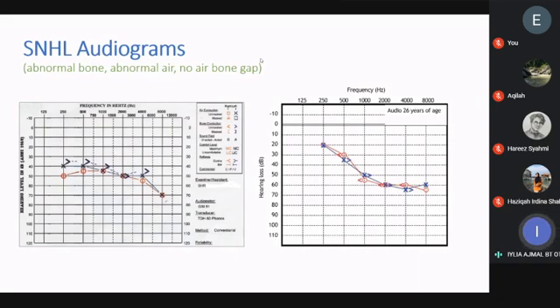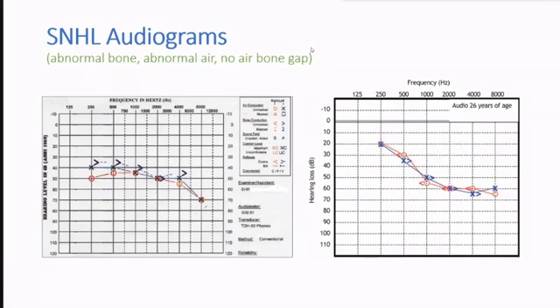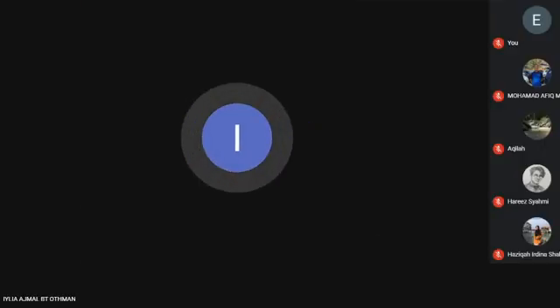So what they mean by three contiguous is when the hearing loss is at 250, 500, 1000, next to each other. That's what is meant by contiguous. Or it can be like 1, 2, 4 kilohertz, like that. Because if it's not, like maybe 500 is lost, but 1000 is normal, 2000 is normal, then there's a drop in 4000, that's not what is meant by three contiguous or sudden hearing loss. Can you understand? Okay.